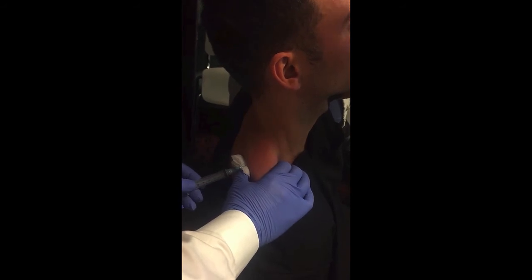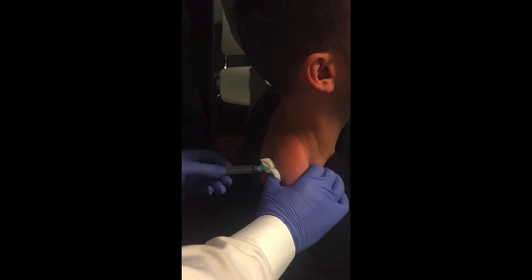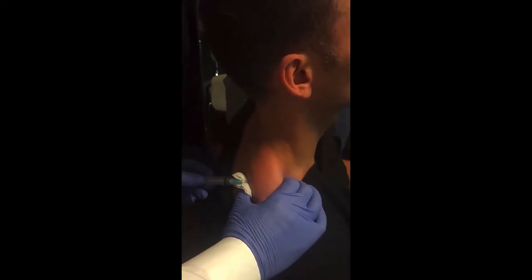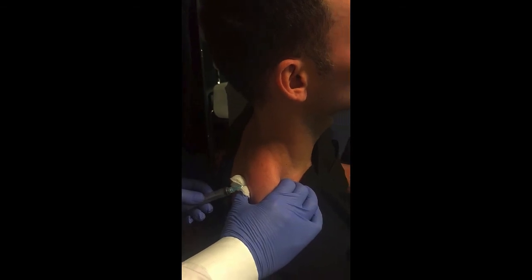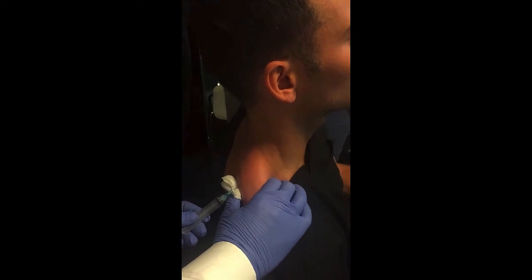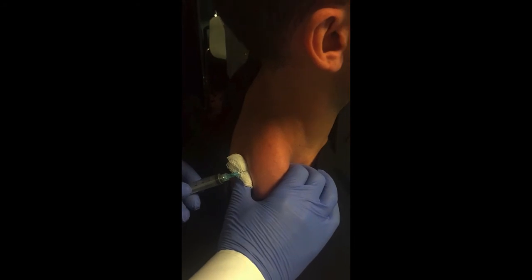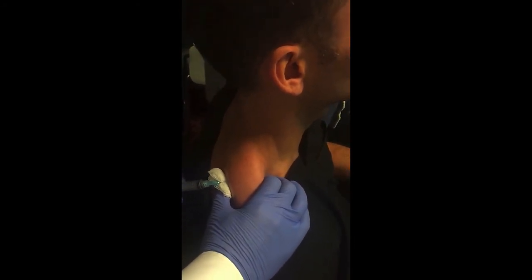And we're probably going to get another twitch — we might, we might not. So you can see I'm just kind of gliding out. And the reason I like these syringes better, my touch on this is really light. Why are you gliding around? Because that's the trigger point — I'm just looking for knots. And this is where I'm intentionally trying to induce inflammation.